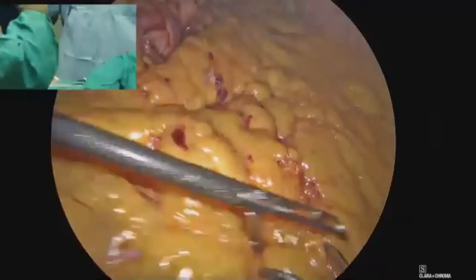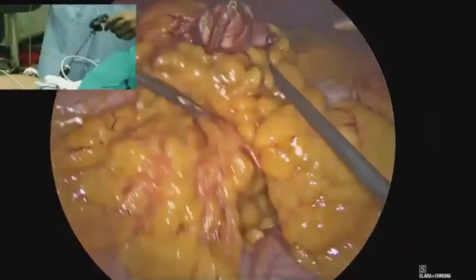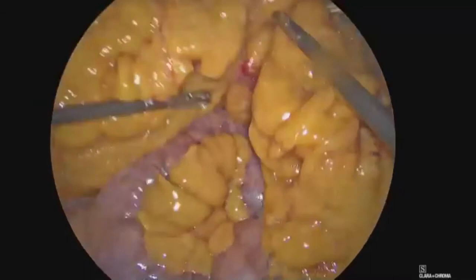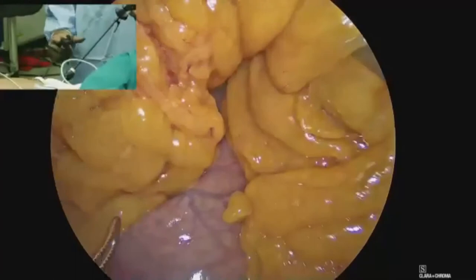Now, the most important part is to count the bowel. So I have markings done on my graspers. Both the graspers will have markings. You can see this is a 10 here, and I can have another grasper with the marking. So these are both 10 marked here. Now, what I wanted to express even before, the bowel is not that dilated, you can see. And usually what I realize is that even if we have some air which comes from the duodenum to the small bowel, it's just the initial 10 centimeters.